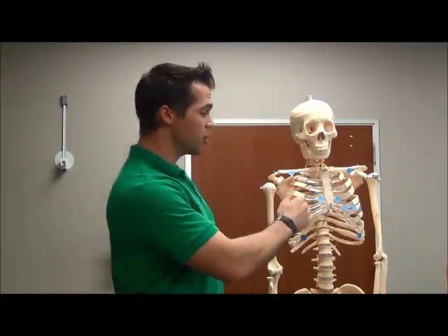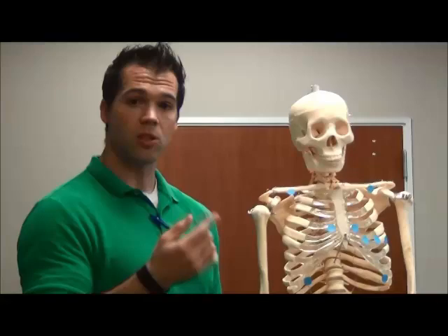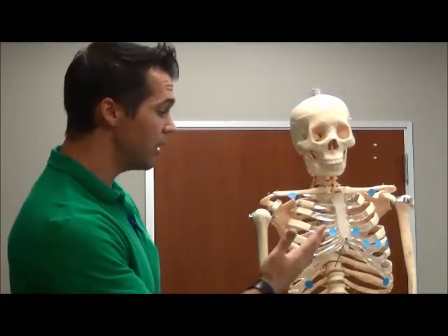And then what you're doing is you're really wrapping the heart. So the chest leads, we label them by V. So V1, V2, V3, V4, V5, and V6 are the six chest leads. And it really wraps the heart.